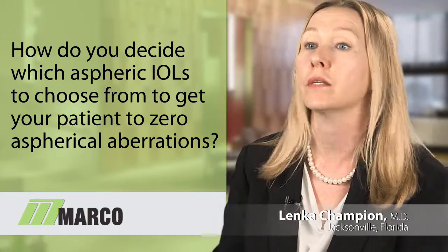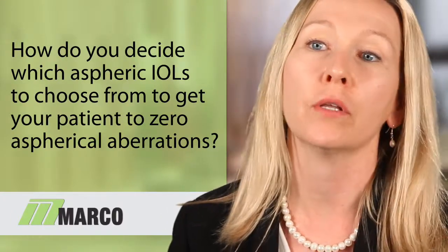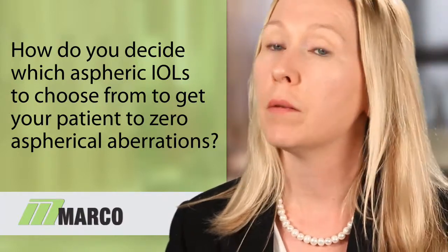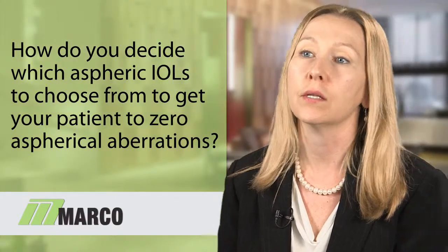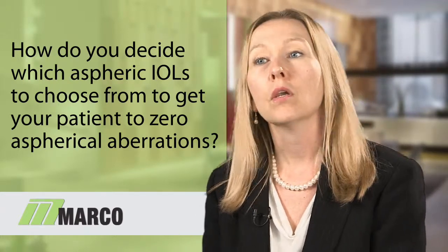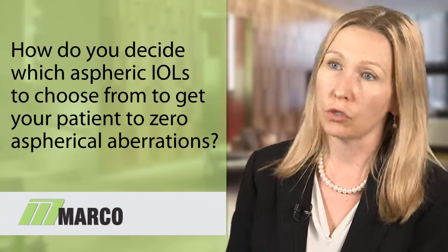The asphericity is a very important concept, and we're just beginning to understand the significance of it. We know that a negative spherical aberration actually adds to the depth of focus for patients and increases their ability to be able to see at near. We also know that positive spherical aberration is not good, and increasing that aberration can actually defocus patients and decrease their contrast sensitivity.